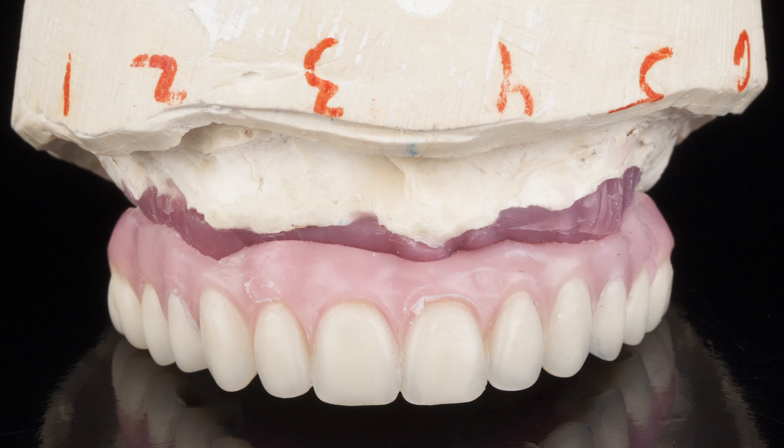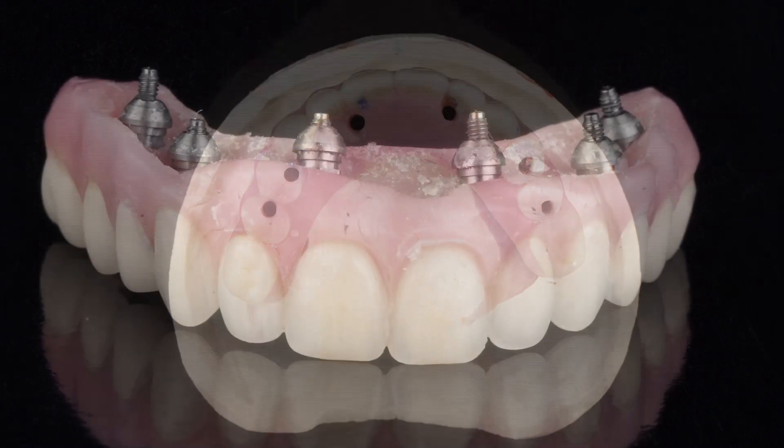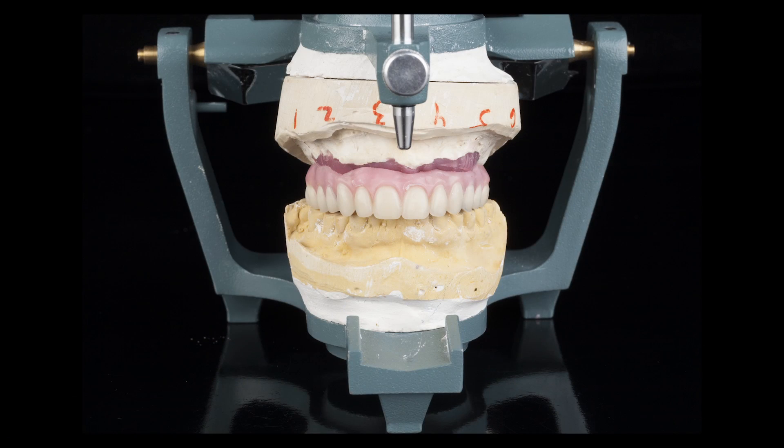For the next appointment, a conventional wax setup was fabricated, including denture teeth to help the lab technician establish proper horizontal and vertical positioning. Figure 13 shows a wax setup that was mounted on an articulator along with the opposing model to verify the accuracy of the prosthetic design.